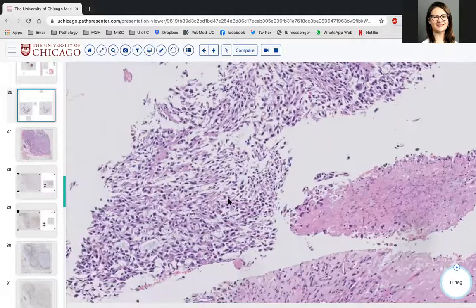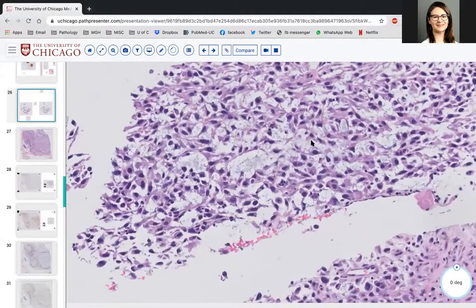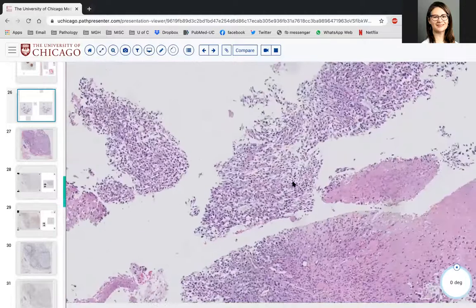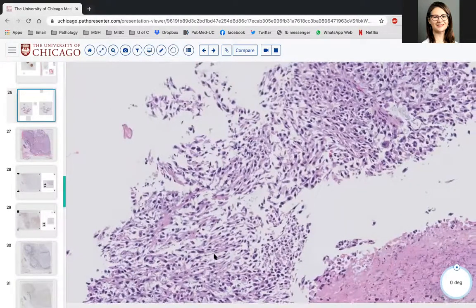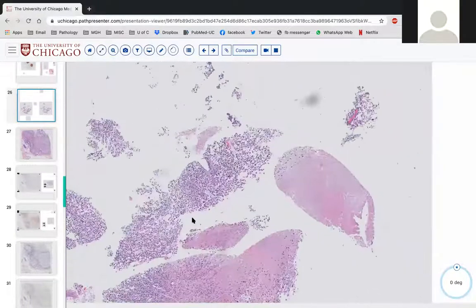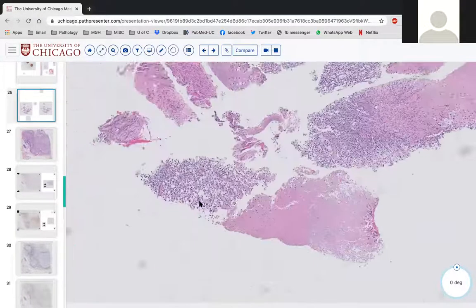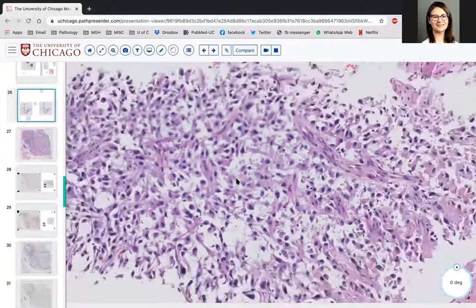True. I think the things that suggest salivary origin are perhaps the myxoid stromal background. Certainly spindling you can see in various types of tumors, including metastatic melanomas and squamous cell carcinomas. But we could imagine these being sort of spindled myoeps, I suppose. So exactly. All right, great.